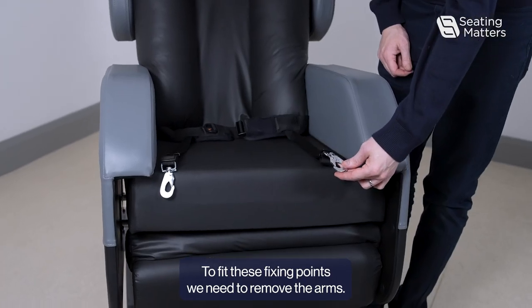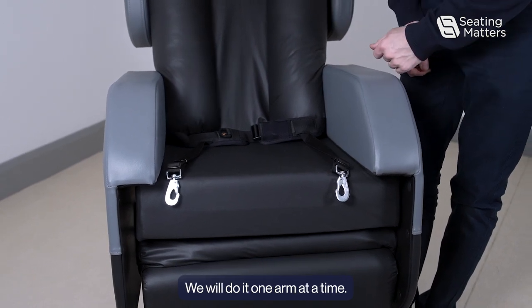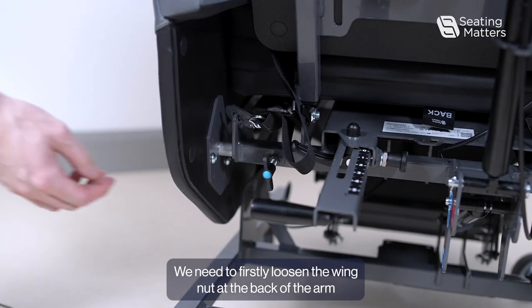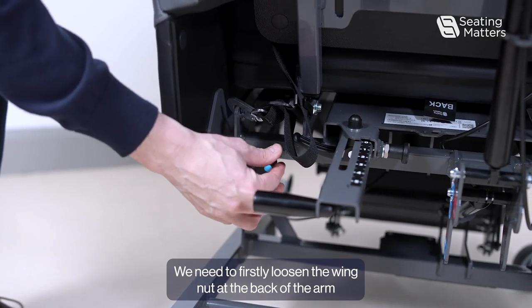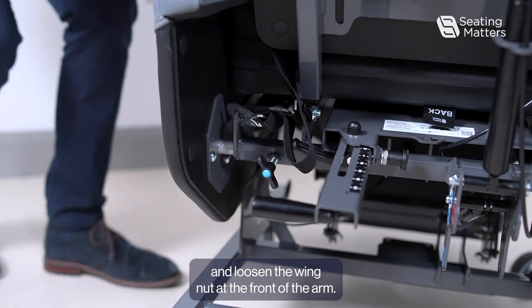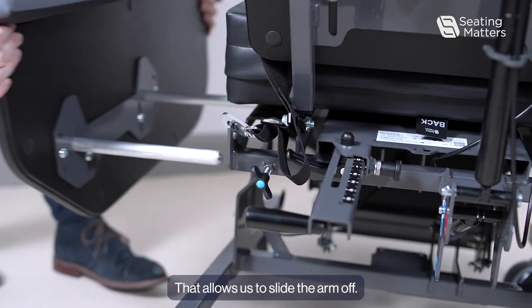To fit these fixing points, we need to remove the arms. We will do it one arm at a time. To remove the arm, we need to firstly loosen the wing nut at the back of the arm and loosen the wing nut at the front of the arm. That allows us to slide the arm off.